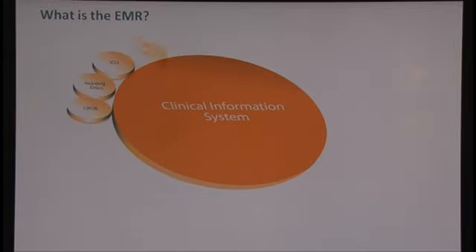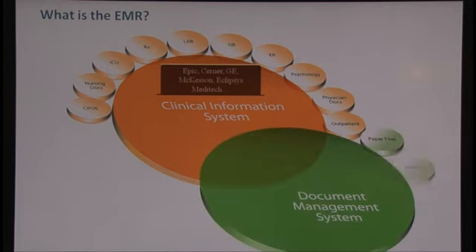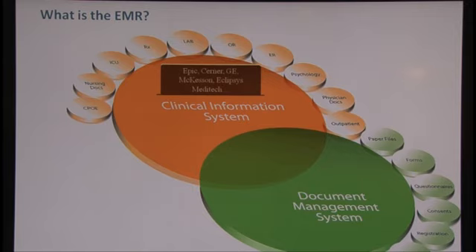So I'd like to speak a little bit about what is an EMR in healthcare today. Most organizations have a core clinical information system that helps manage multi-departmental workflow, results, orders, and things of that nature. Most organizations have a system by one of the core key clinical information systems vendors such as Epic, Cerner, GE, etc. These organizations also typically have a document management system, and this document management system is in place because it manages a different type of data than the core clinical information system is designed to manage, such as registration, consent, discharge forms, typically paper documents.